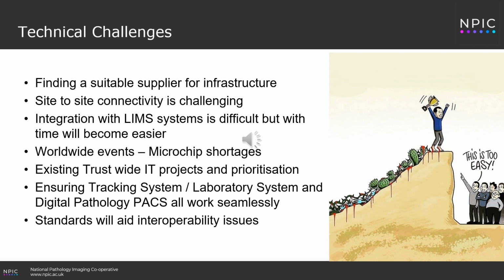Having integration between the LIMS is difficult, but with time it will become easier. And the reason why I say that is currently, we have a mixture of hospitals using lab information systems that are really old and it's pretty impossible to integrate with, versus them being on a roadmap onto a new regional lab information system.